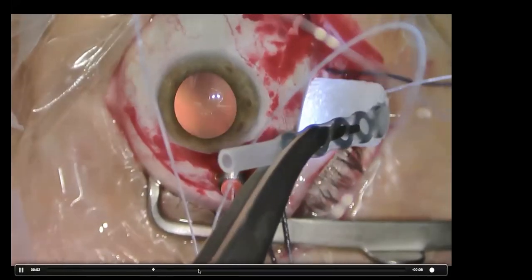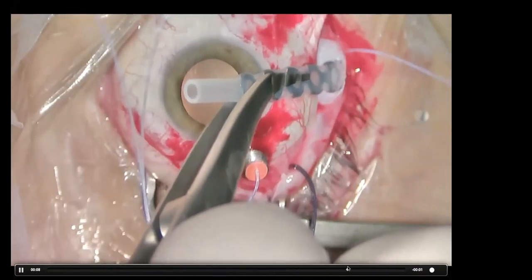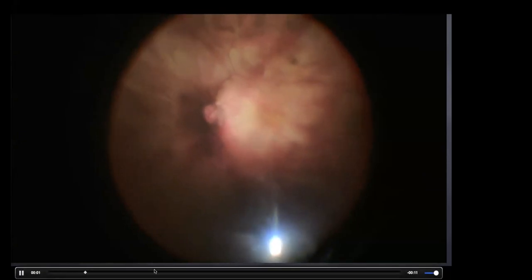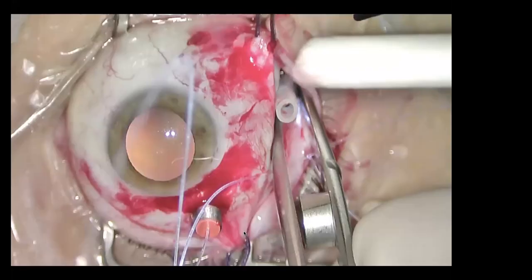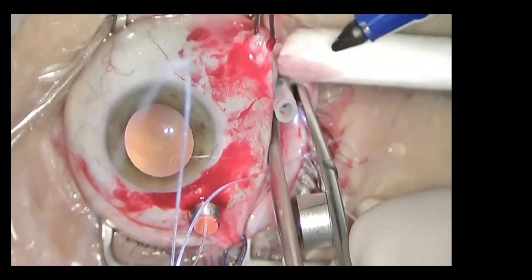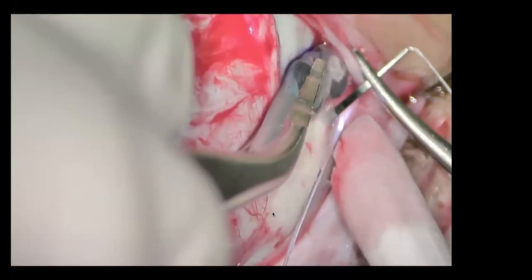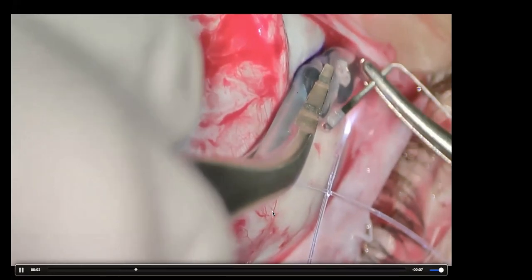Here you see the insertion of the buckle in the superotemporal quadrant. I used to watch the position through a panoramic viewing system, and then I would remove the system and suture the buckle close to the insertion of the muscles, like here, with the mattress suture.